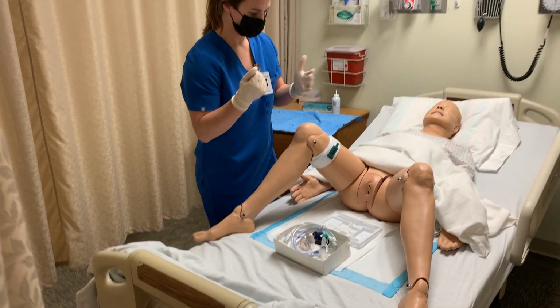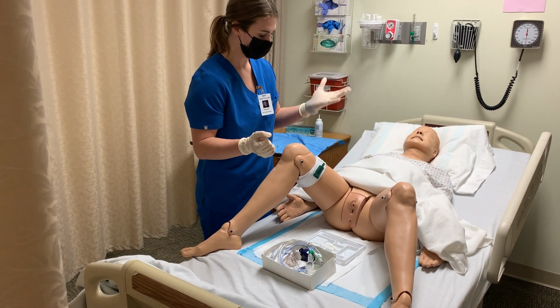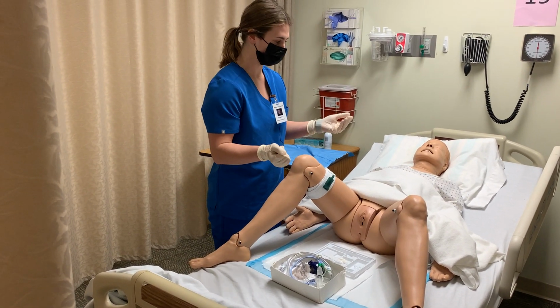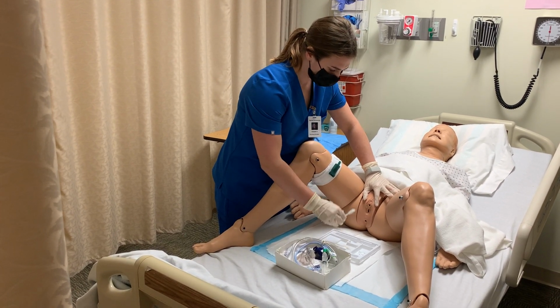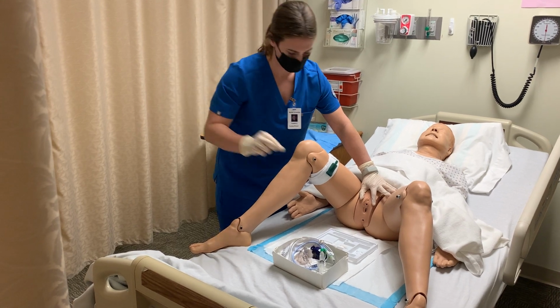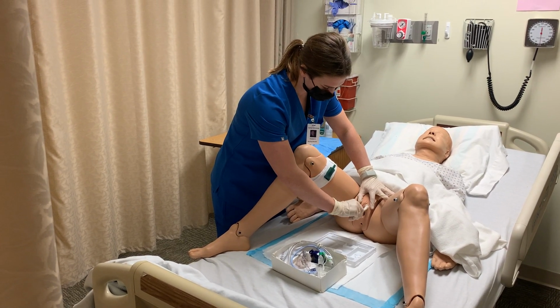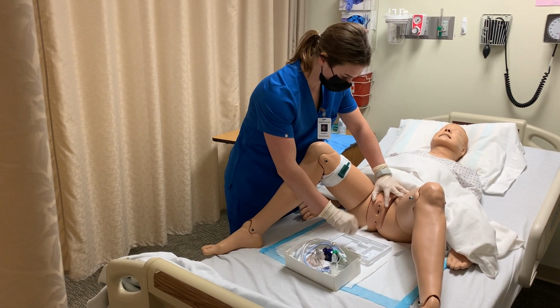Okay. So now we're gonna go ahead and just prep the perineum to make sure it's clean. You might feel a little bit of coolness as the swab goes. So we're gonna start from the outside. Center.